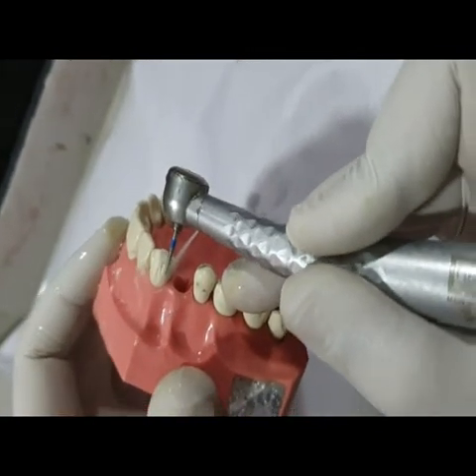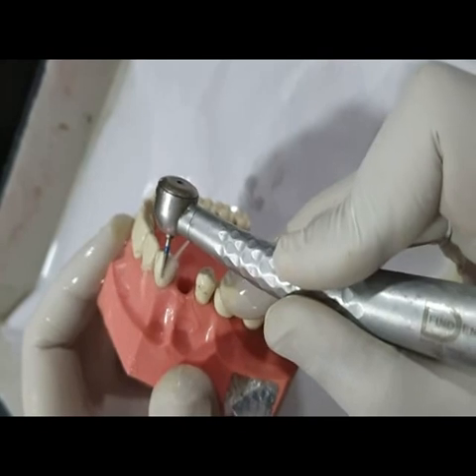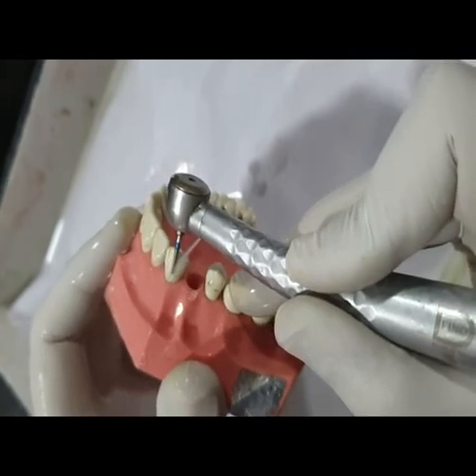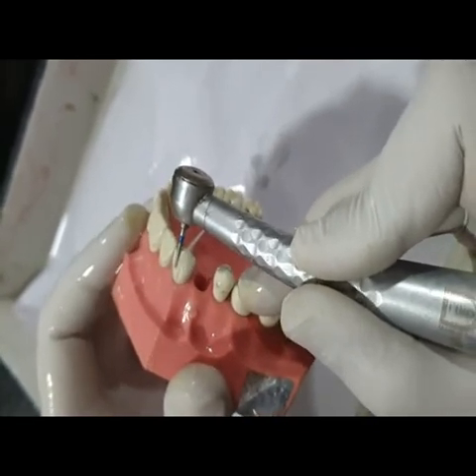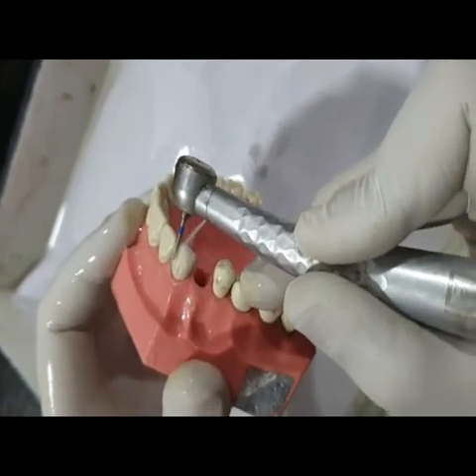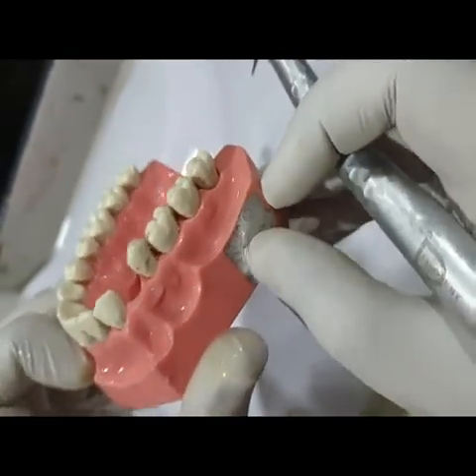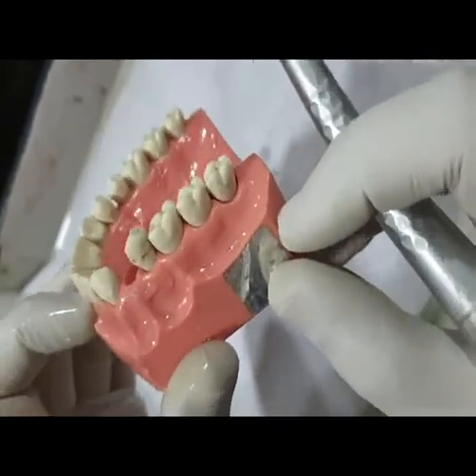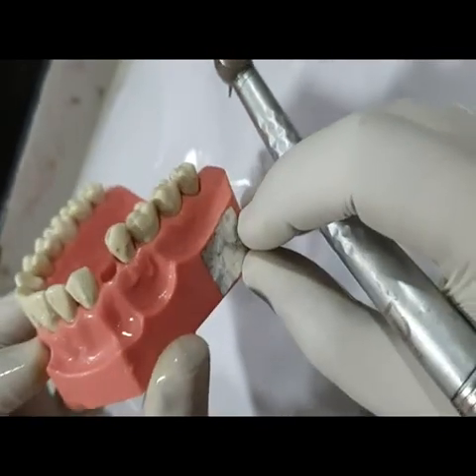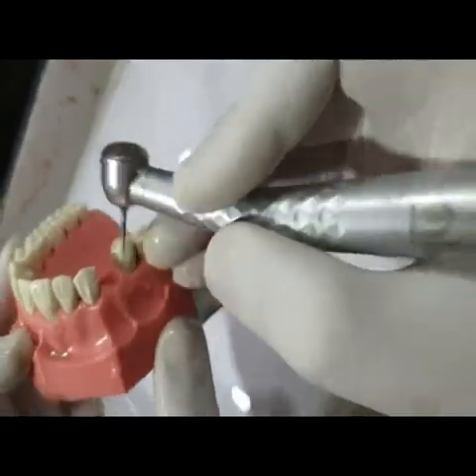Now I am reducing the incisal two-third area. Please note that the tip of my bur is only moving in the incisal two-third region — it is not going to the cervical region. This is very important for the biplanar reduction we want to achieve. After completing the incisal two-third reduction at a different plane, now we will go to the cervical one-third in which the axis of our bur should be parallel to the long axis of the tooth.